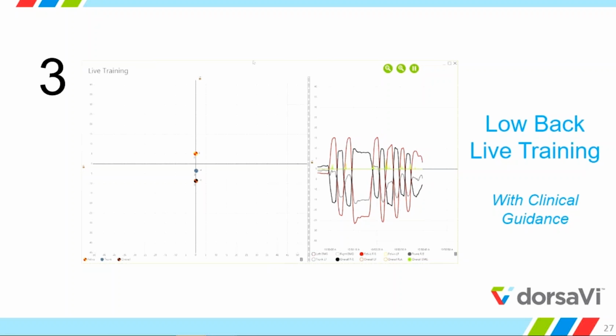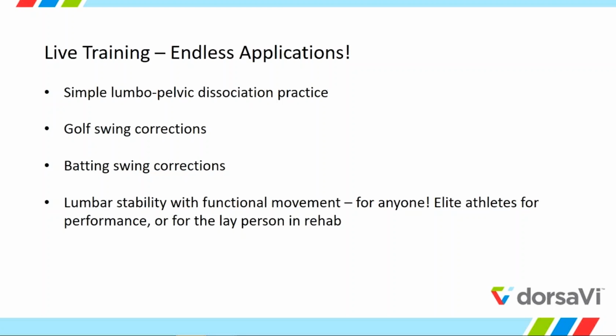Okay, so that's the basic use. You can do it in standing, you can do it in quadruped, you can do it on the ball like they showed in there. There are endless applications because it's just raw data and real-time information.